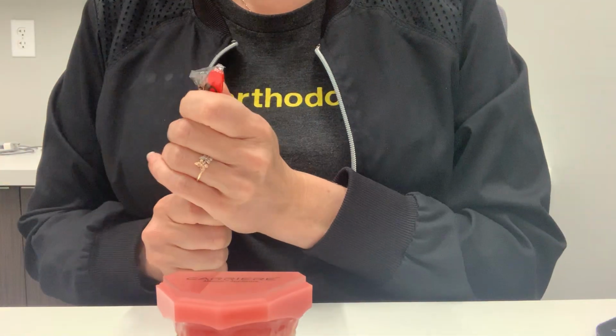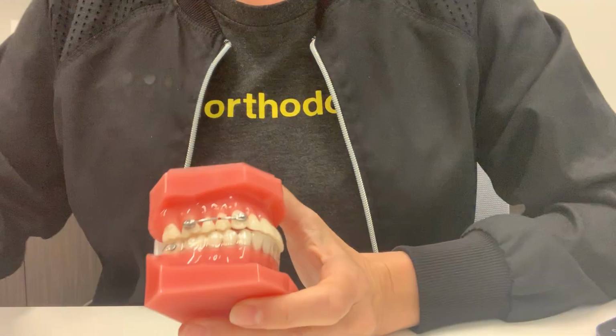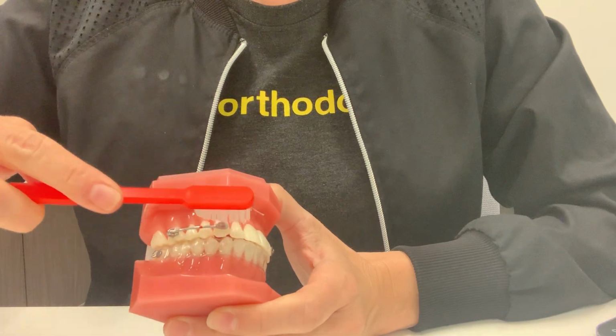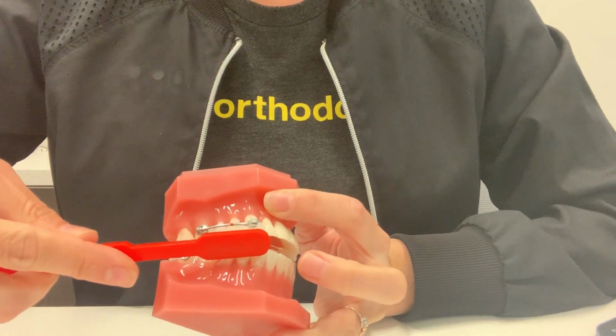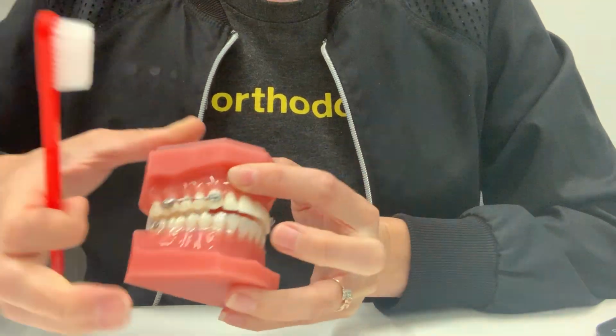To brush with the motion appliance, you're going to take your toothbrush above the appliance, brush in a circular motion, then directly over the top of the appliance, brush in a circular motion. Then you're going to put the toothbrush underneath it with the bristles angled up and brush in circles.